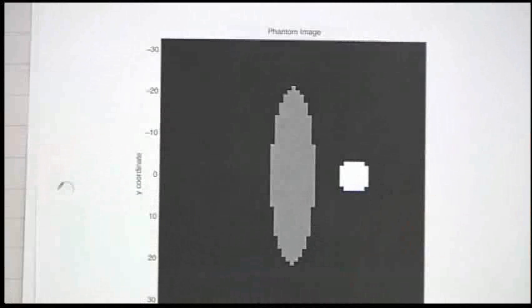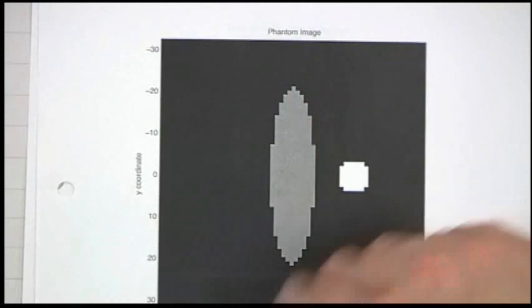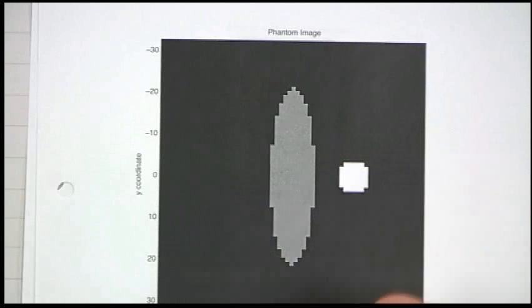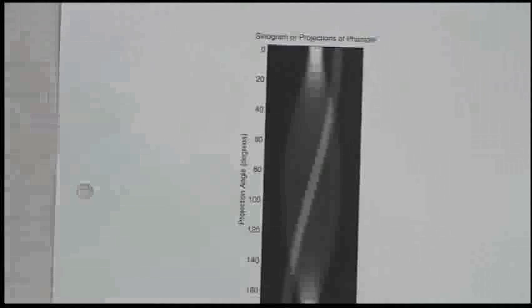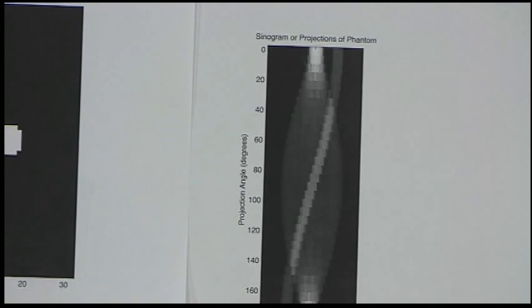So you get staggered sampling, and that's helpful because when you stagger the sampling, you get more points in between. So in practice, they actually do scan more than 180 degrees because there's some benefit to it. But theoretically speaking, if you had continuous perfect sampling, you wouldn't need any more than 180 degrees, and there's no noise. There would be nothing to be gained. Okay.